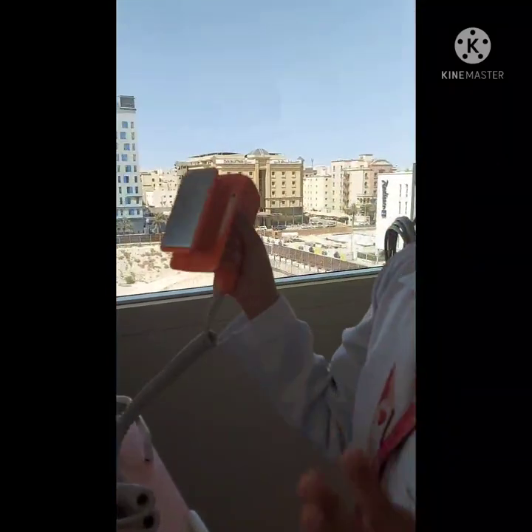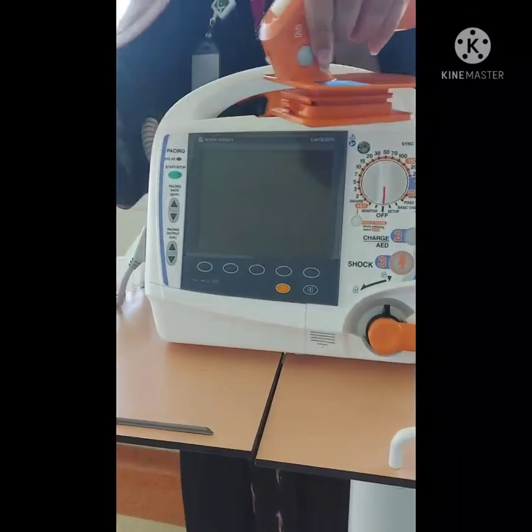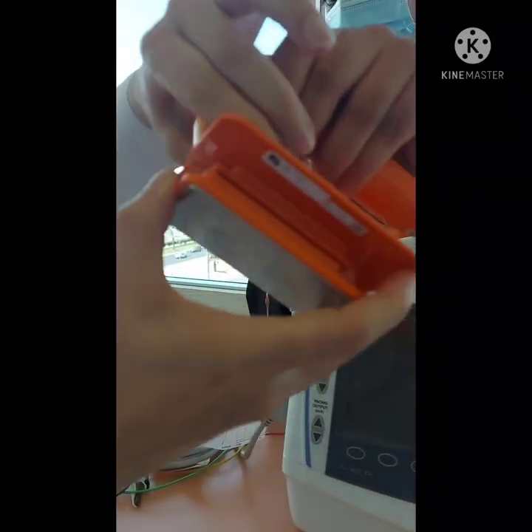Oh my god! Easier. Just press this one. Press and pull. And then push. Again.